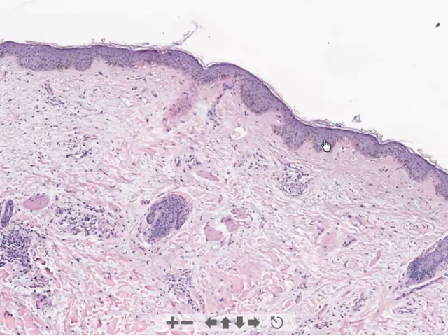The one characteristic that this specimen has, which you can also see in erythema multiforme, is a relatively intact basket weave appearance to the stratum corneum. However, the other features which we have mentioned help to differentiate this particular case of dermatomyositis from erythema multiforme.